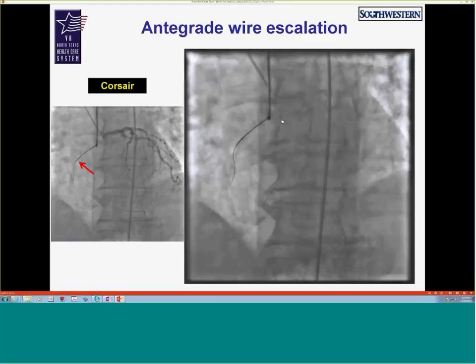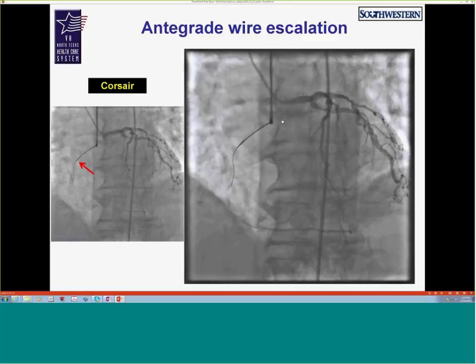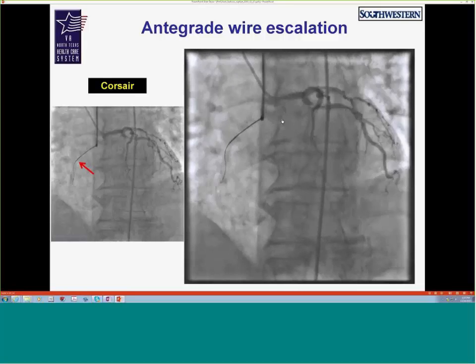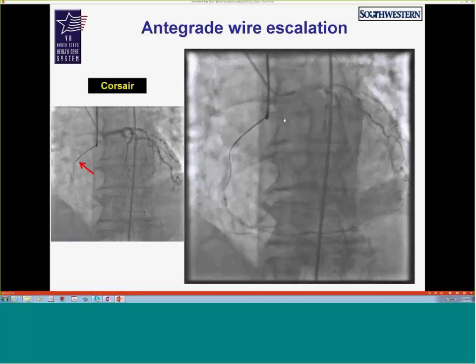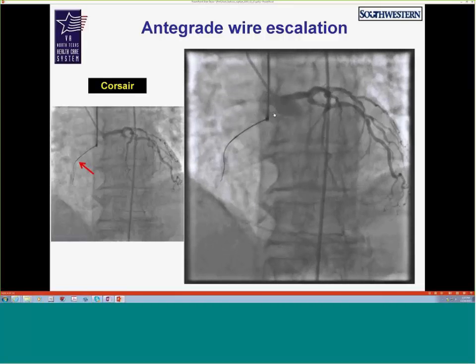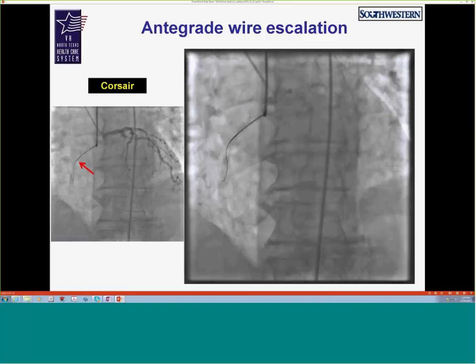One of the difficulties we had in this case is that it was very hard to engage with the guide catheter. I think we tried 6 or 7 guides, AL1, AL.75, XB, IM, TAMP, and the final one that was able to work, I think it's an AR1, is the only one that could actually engage the right coronary.